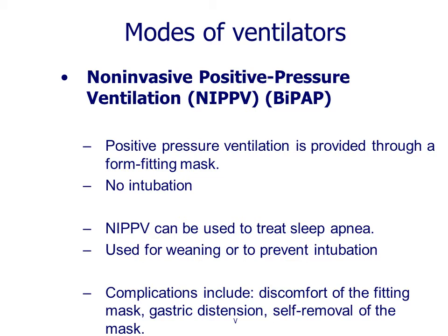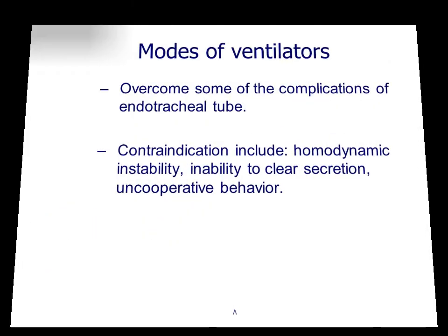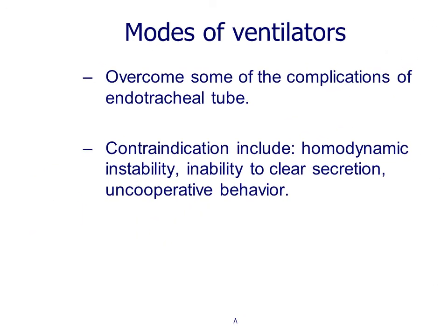Complications: discomfort from the fitting mask, gastric distension, and self-removal المريض بيقدر يشيله لحاله. It's used to overcome some of the complications of the endotracheal tube. هذا non-invasive positive pressure. لكن contraindication إذا كان المريض hemodynamic unstable and unable to clear the secretions and patient who is uncooperative.